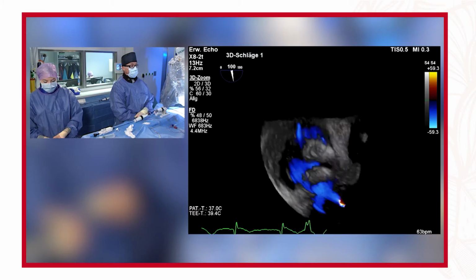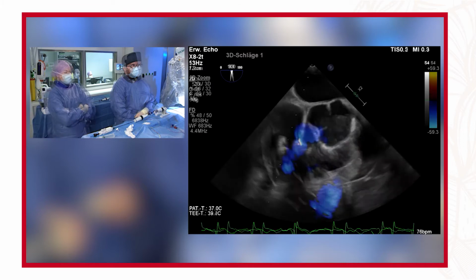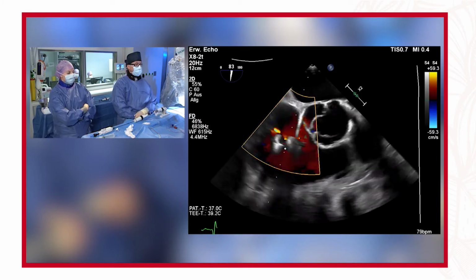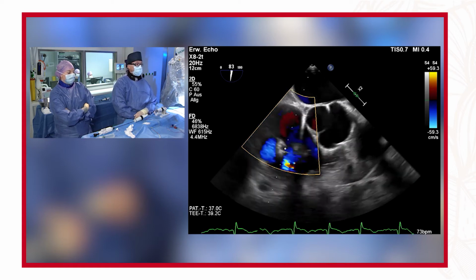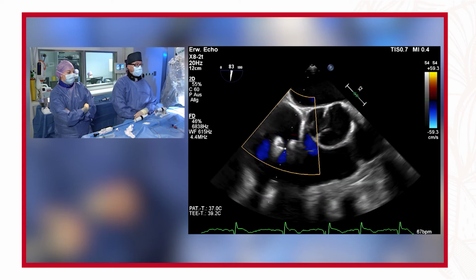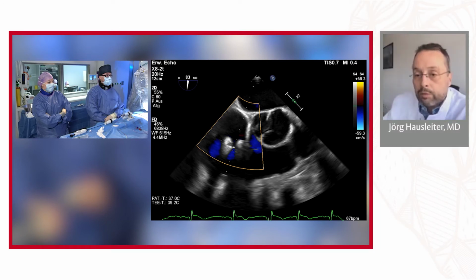And with the detached systems, also a very good and durable result, which has not been influenced by the release, just very tiny jets remaining mainly between the two devices and one small jet from the posteroseptal line of coaptation. So with this, I think we could demonstrate that with the insertion of two PASCAL systems, we were able to reduce the TR from a grade 4, as we measured it before the procedure, to a grade 1 at the end of the procedure.